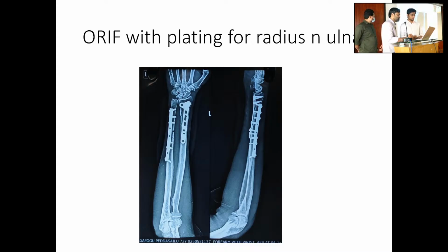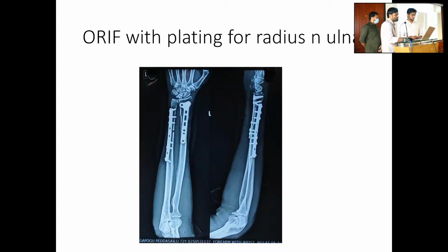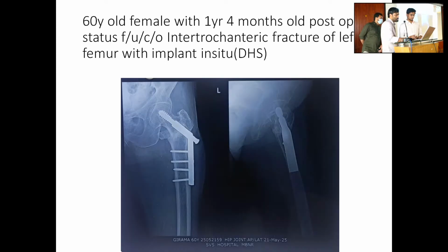Ellis plate, it can't do the distal radius. The distal fragment in the radius is too short, it doesn't have a good purchase with the regular DCP, yes, sir. It will hardly have only 2 screws. So you get a better purchase, both horizontal as well as vertical.